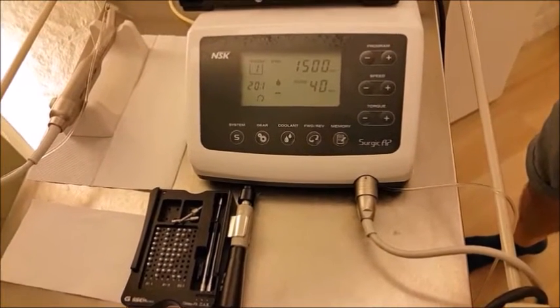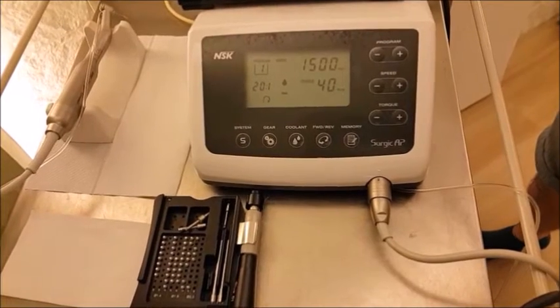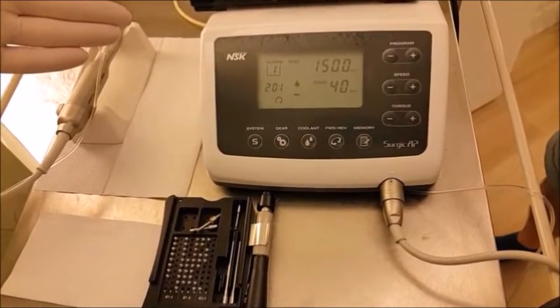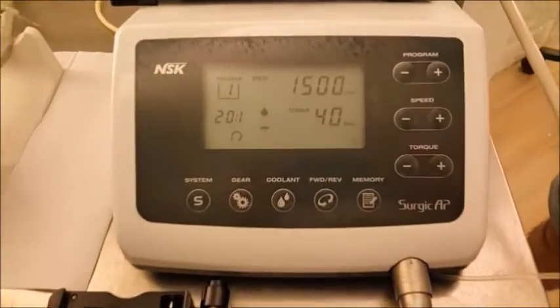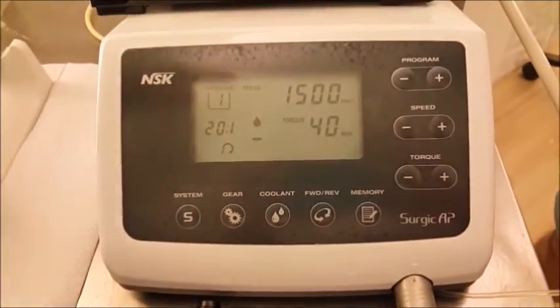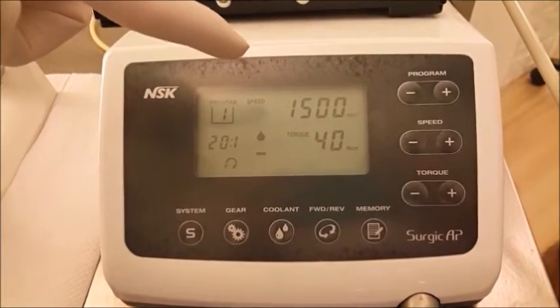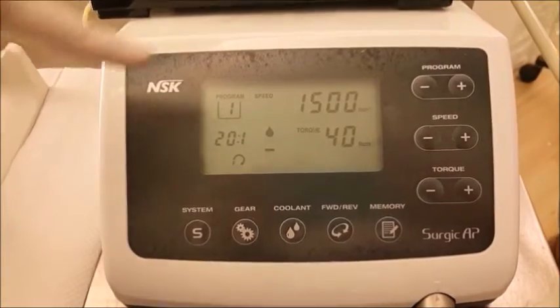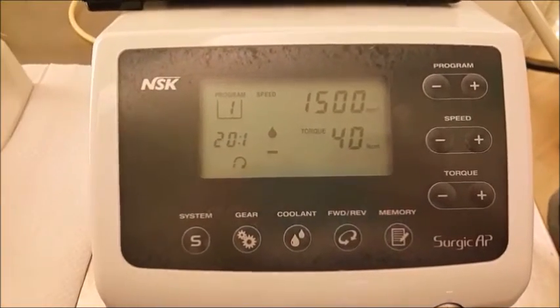Before we get started, we need to make sure we have all the bits and pieces and equipment ready. We have an implant motor - that would be the best way to go about the placement. Set the speed at 1500 revolutions per minute and torque at 40; do not exceed this figure. Just a little bit of irrigation, set at the first level.